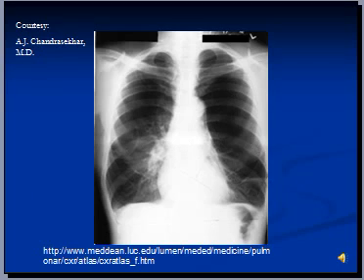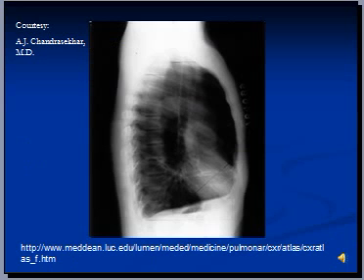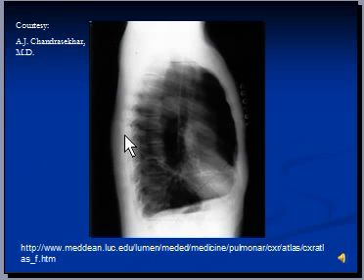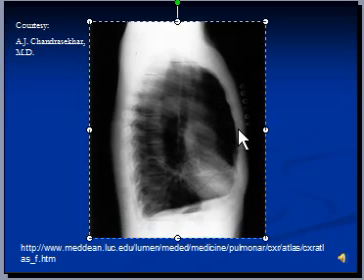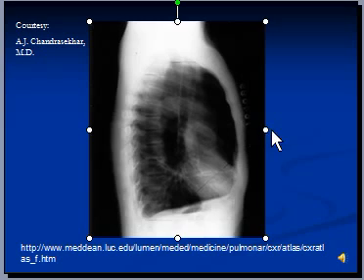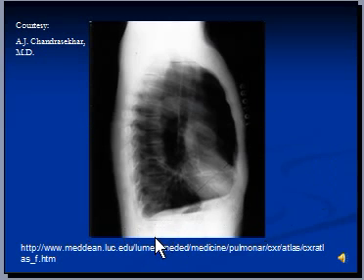On the lateral view, the lungs are again hyperinflated with a barrel-shaped thoracic cavity. The anteroposterior (AP) diameter is increased — another feature of emphysematous lungs. The diaphragms are very flat, whereas on a lateral view you should normally see a dome-shaped diaphragm.